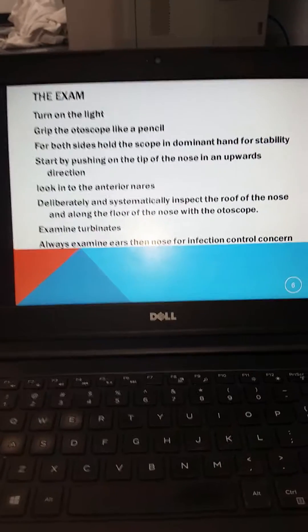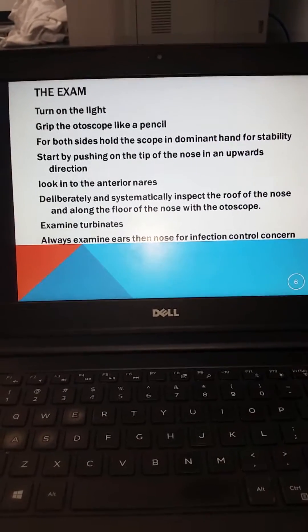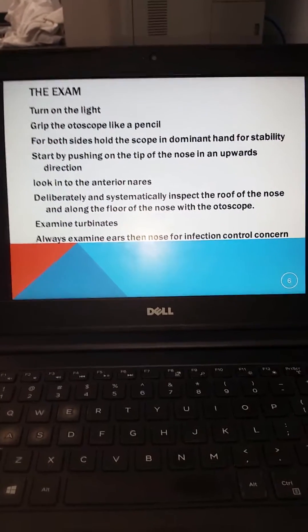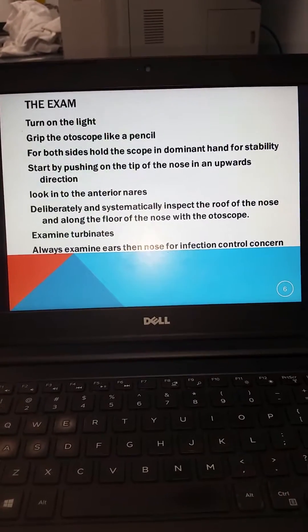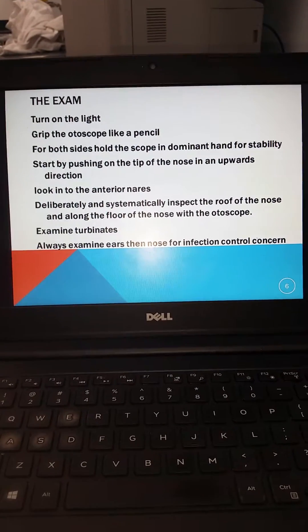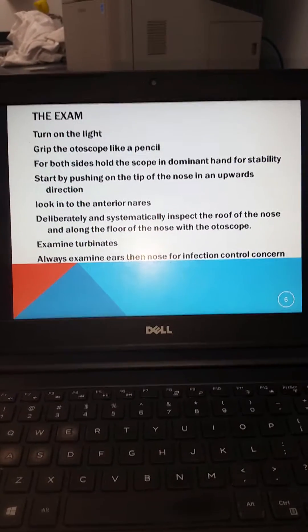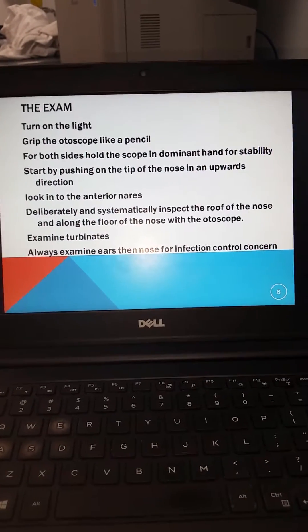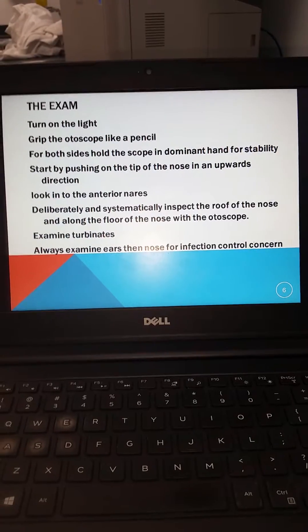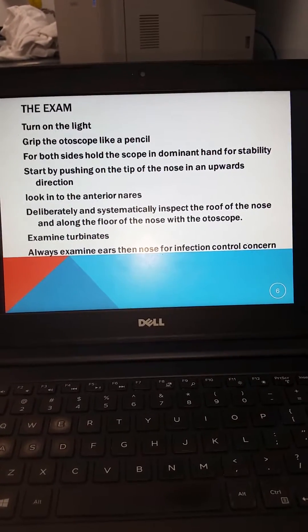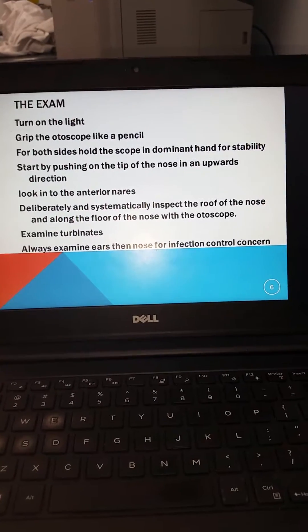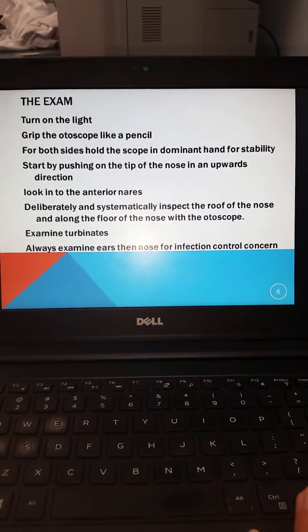Your examination begins after your GRIP — turn on the otoscope, holding it like a pencil. For both sides, hold the scope in your dominant hand for stability. Start by pushing on the tip of the nose in an upward posterior direction to allow you to look into the anterior nares. Deliberately and systematically inspect the roof and floor of the nose with your otoscope and examine the turbinates. Remember to always examine ears before the nose for infection control concerns.